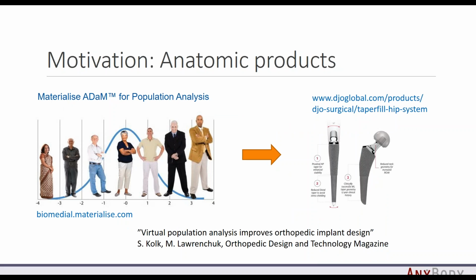Another large company called DJO Surgical uses Materialise's ADAM database for population analysis in creating and optimizing the taper-fill hip system, which highlights the need of using more accurate bone morphology information for producing competitive products. These designs can also be tested using multi-scale computational schemes.